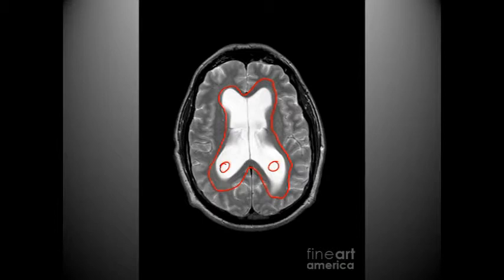There can be varying degrees of why this patient does have widening ventricles, why there is hydrocephalus, but primarily there's just a buildup of cerebrospinal fluid that cannot escape, or overproduction of cerebrospinal fluid. And if you'll notice, this gives the brain an appearance of being much older than probably what the patient is.